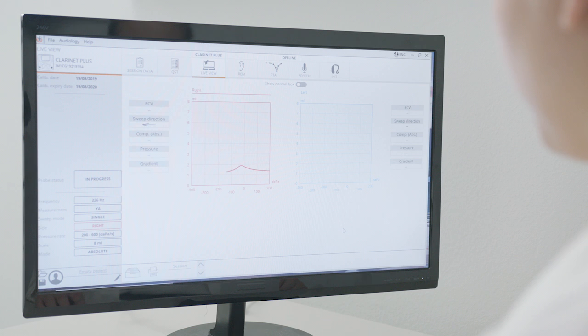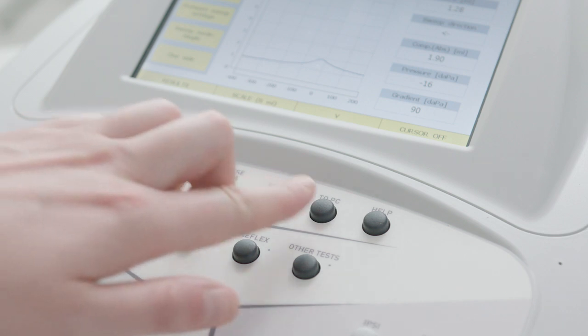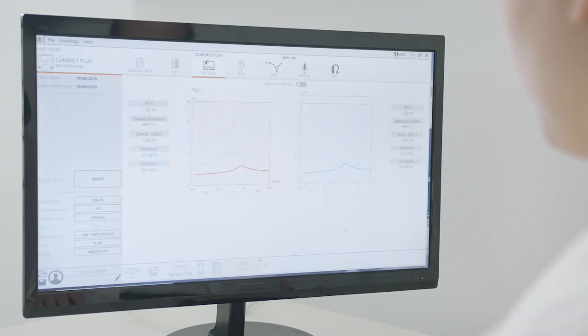Maestro's live view function can be used to follow a test that's currently in progress on the computer screen. When an examination has been completed, it can be transferred to the Maestro archive by simply pressing the to PC button on the instrument.